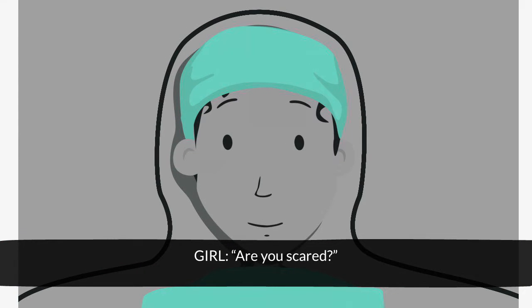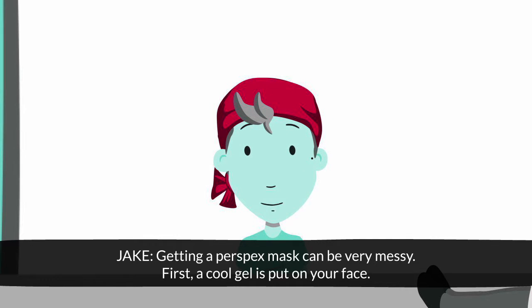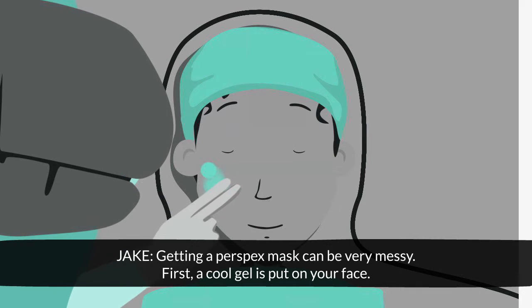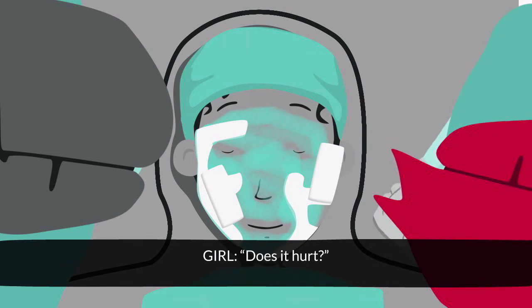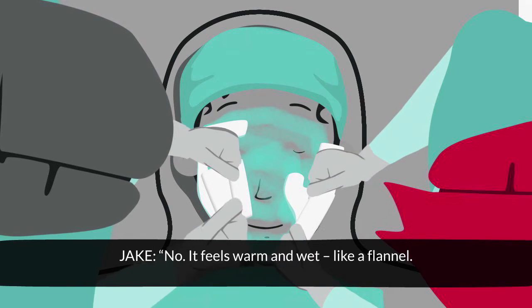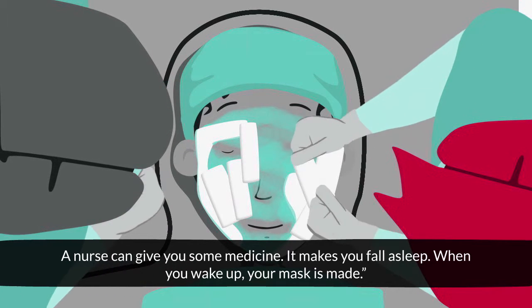Are you scared? No, not at all. Me and my play therapist made a mask for my teddy. Getting a perspex mask can be very messy. First, a cool gel is put on your face. Then special strips covered in a mixture of wet plaster are put on. Does it hurt? No, it feels warm and wet, like a flannel. If you feel scared, tell someone. A nurse can give you some medicine — it makes you fall asleep. When you wake up, your mask is made.